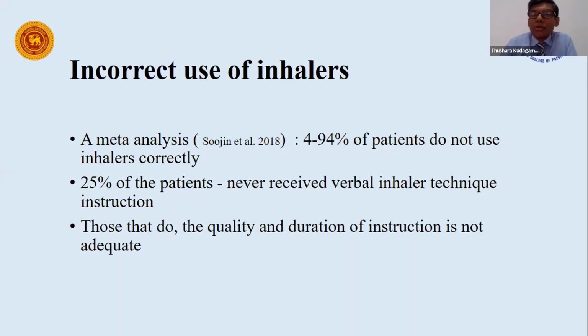It has also been shown that 25% of patients never received verbal inhaler technique instructions, and even for those who were given, the quality and duration is not adequate. So the point I want to make is that all of us should have something to improve, and there's room for improvement in all of us.